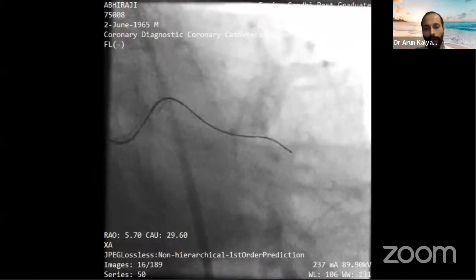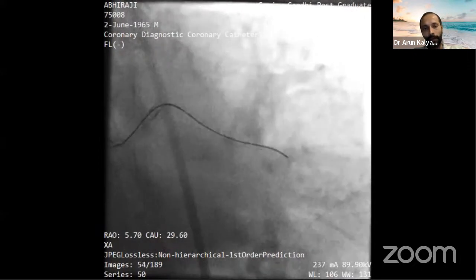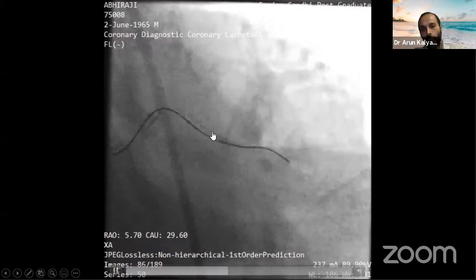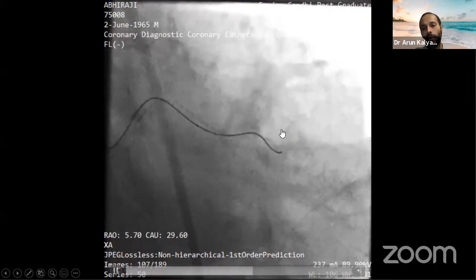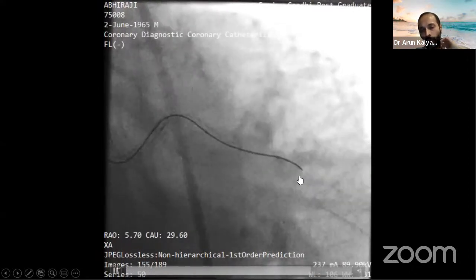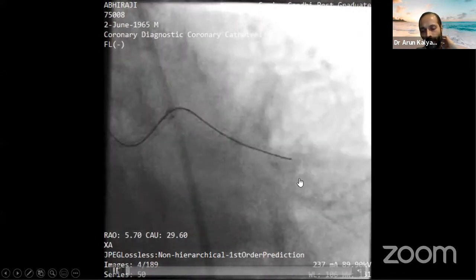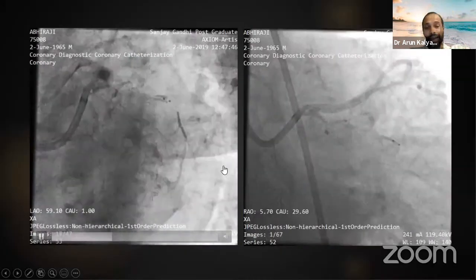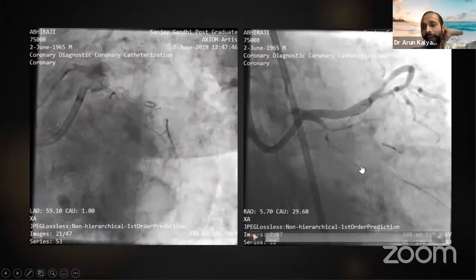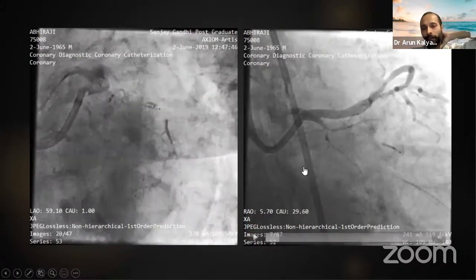And here, I kind of got the Caravel down, put in a Miracle 12, and that's the Stingray balloon. The two dots that you see here is the Stingray balloon catheter that's being advanced over the Miracle wire. And we knew from the initial angiograms how far to go. And that's the Stingray balloon catheter position. I had to take a picture just to be sure I wasn't way beyond the distal landing zone, and I wasn't. Now, the problem was I had no idea where the vessel itself was.